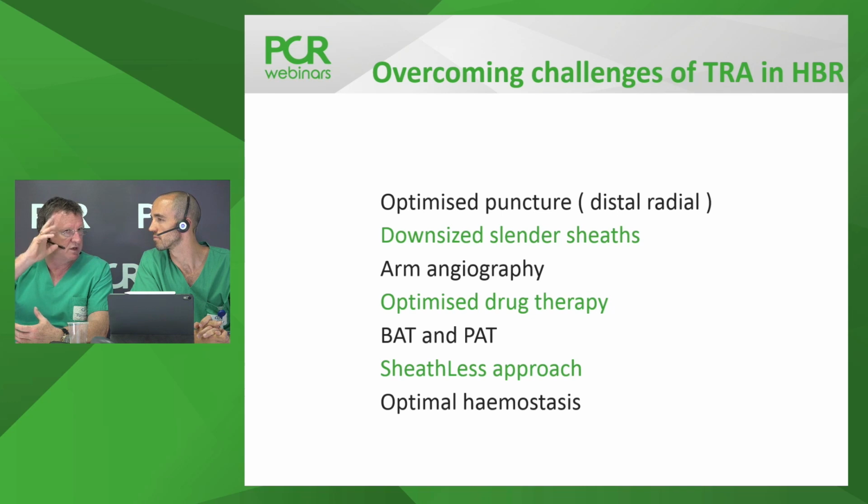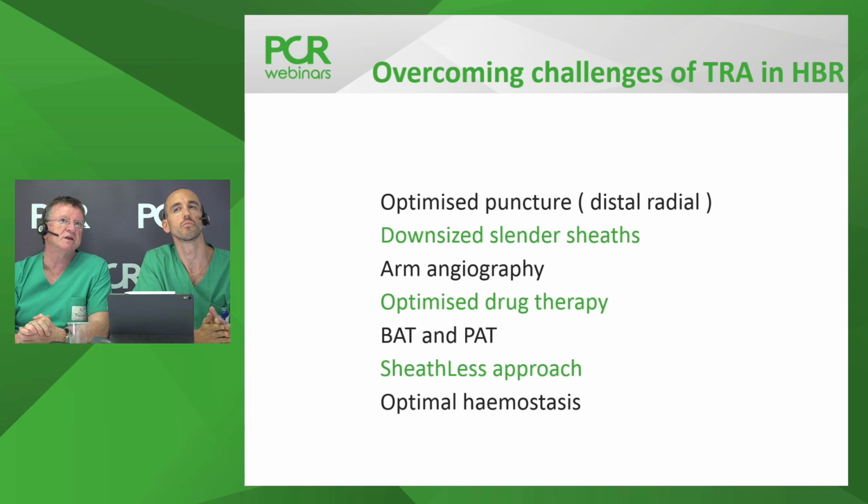Sheathless approach is a way of using larger diameter guides in small vessels. I mean, you have to really be familiar with the approach. It's not something that I use frequently. Mammas in our center has done a lot of sheathless cases, but it is a little bit technically challenging, and I wouldn't routinely recommend it.